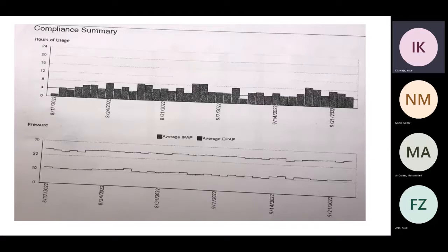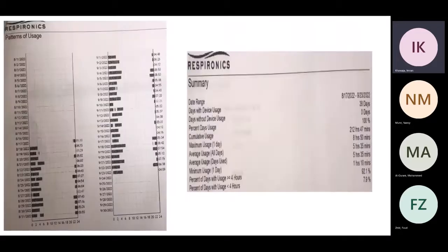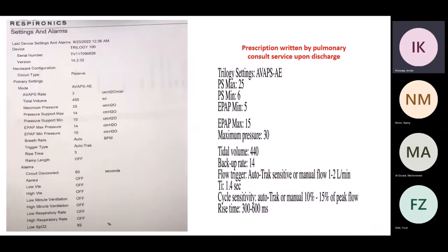When you look at it, it may not be a problem. I thought the max pressure, which is in respiratory, the maximum is 25, right? Yes, the maximum pressure is 25. It could be the other limiting factor though. But if you see, another limit, pressure support maximum, is 14. What will limit you before you reach it?